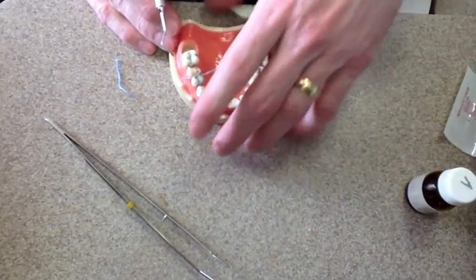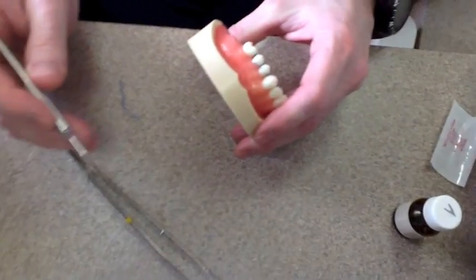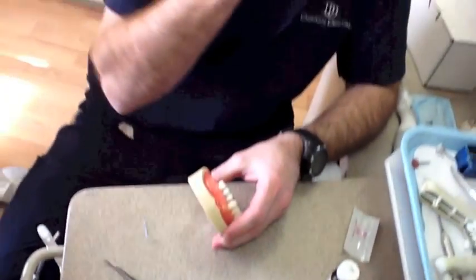When you're packing cord, it's just something you have to practice. It's not about how hard you push. Everyone look at me up here real quick. Everyone wants to push hard. It's not about how hard you push. It's about your angle and how you manipulate that cord. When you push it in, you want to push it and hold it a couple seconds and then out. That's how it stays. Everyone just jams and goes as fast as they can. It doesn't work. Push it in and hold it, and then go to the next one and kind of push it in.